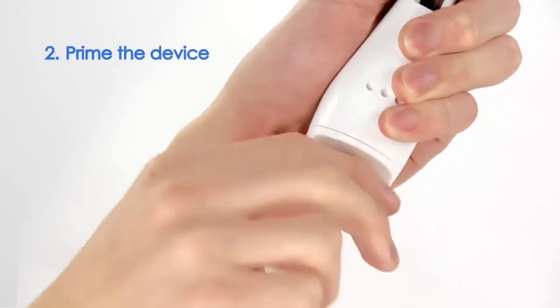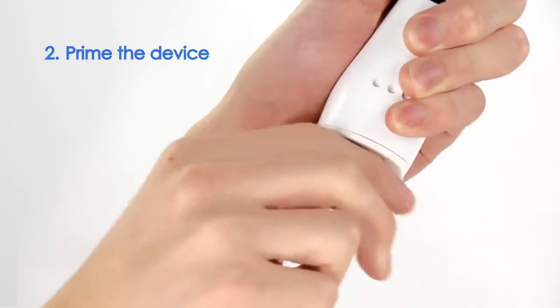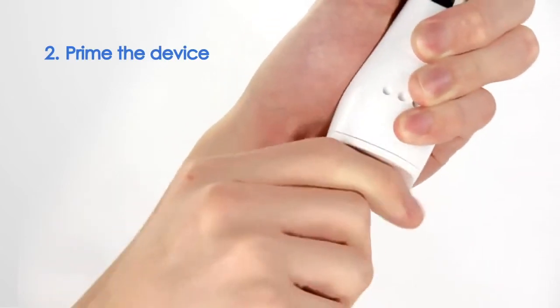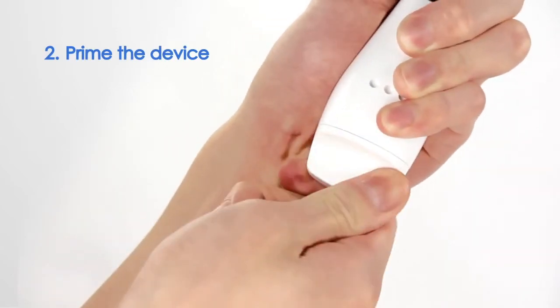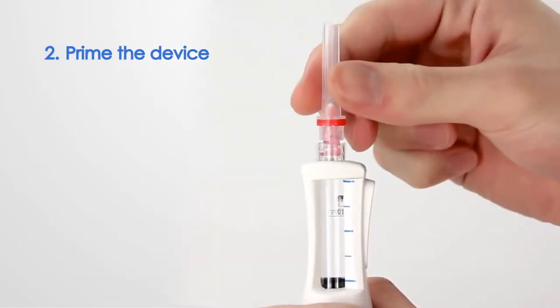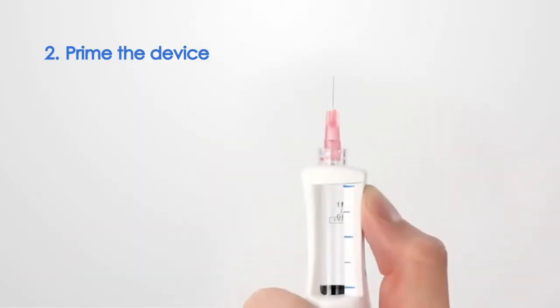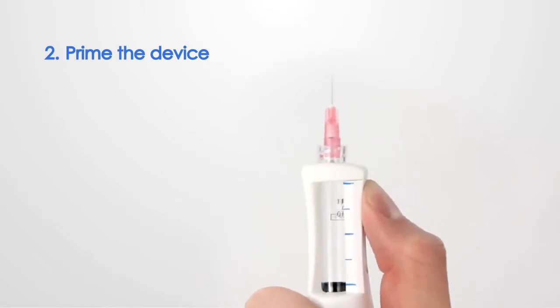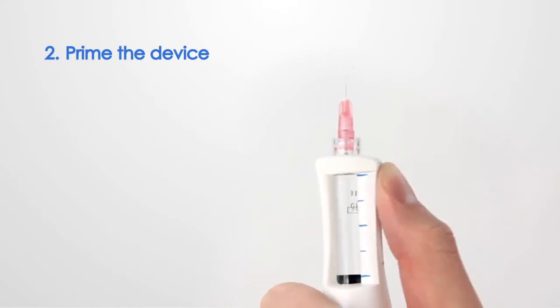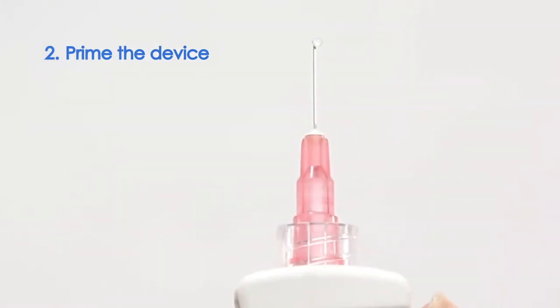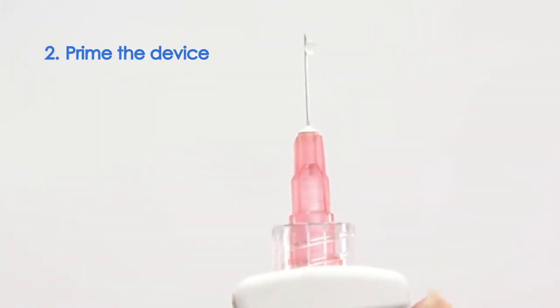Twist the load knob until it comes to a stop. You must now prime the device. Press the Dose Activator on the side of the device until a few droplets emerge from the needle.